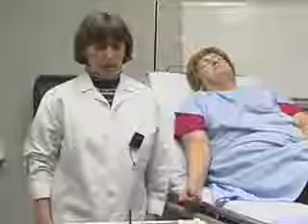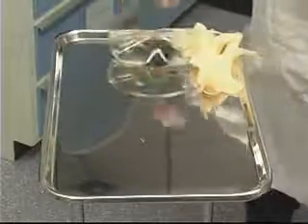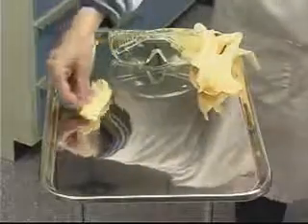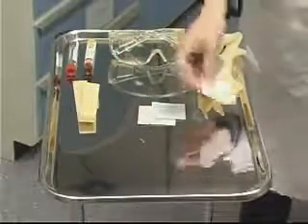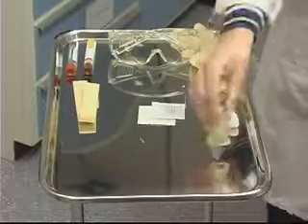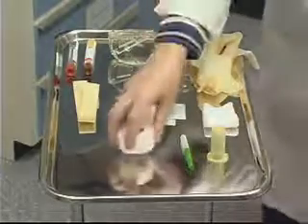Today we'll demonstrate the technique of phlebotomy. The equipment necessary for phlebotomy is as follows: protective gloves, protective eyewear, the necessary blood collection tubes, tourniquet, povidone iodine solution and an alcohol swab for cleaning the skin, a piece of gauze to cover the site after, vacutainer holder and vacutainer needle, and a piece of tape to secure the gauze.